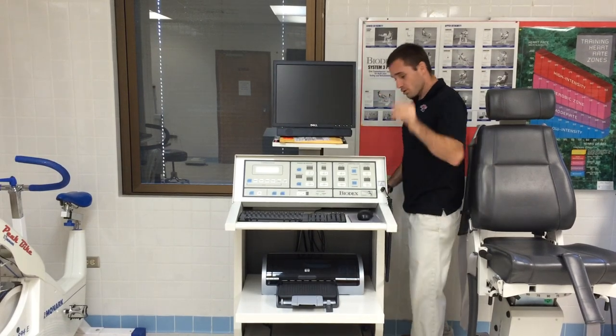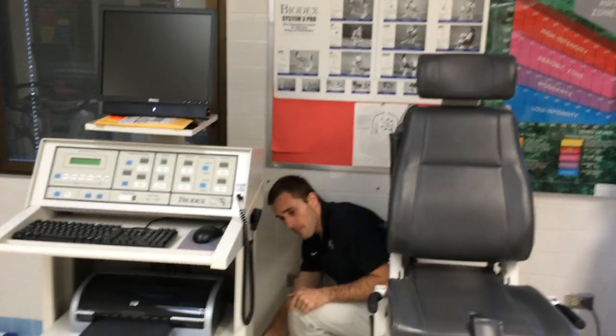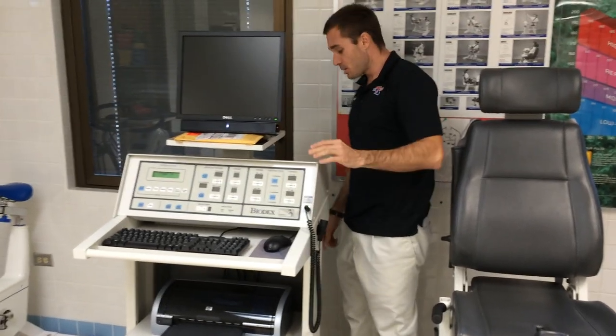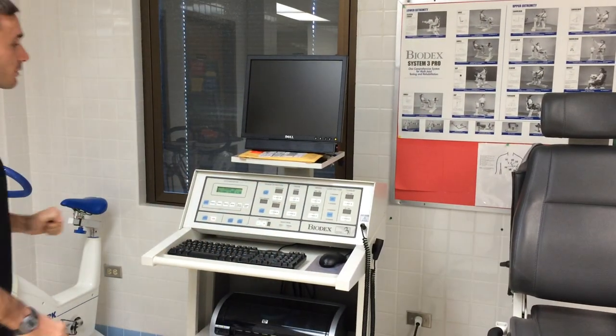Now, I know you can't see from where you are, but if you look right down here, there'll be a switch just behind the dynamometer that says main power. All we're going to do is flip it up. You're going to hear a beep, and you're going to hear the system start to engage. There's only one big switch behind the equipment. You can't miss it. It's pretty easy to find, just in that bottom right-hand side down there.